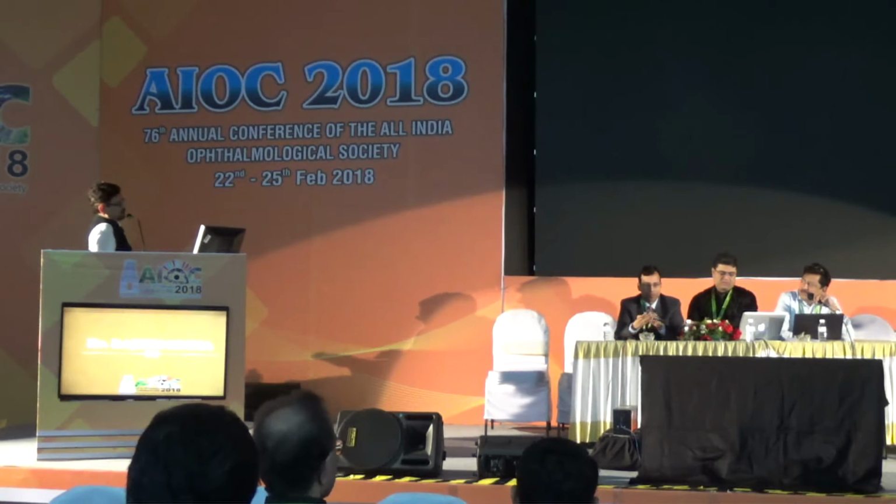And then what about this role of true K? That is the true K actually, because most of the times when we do the keratometry, that's not the true K. That is an estimate of the anterior corneal surface. So the true K means that you have to take care of the posterior astigmatism also. Once you have taken care of the posterior astigmatism, then you get the true K. So that is the net effect of the astigmatism, from the anterior surface as well as from the posterior surface.